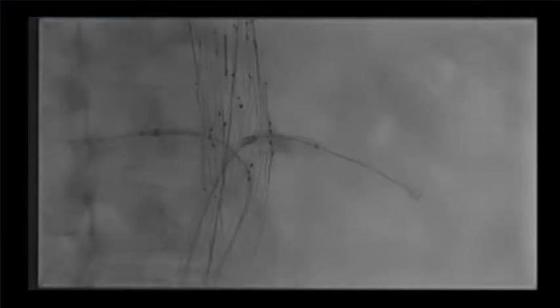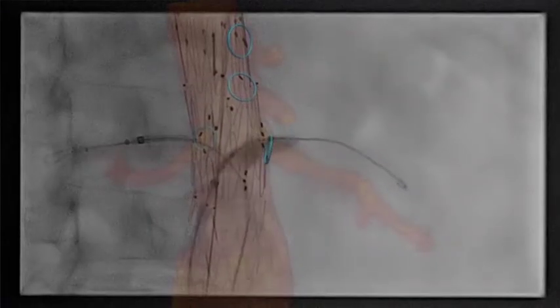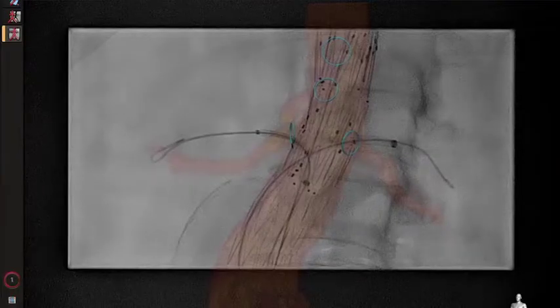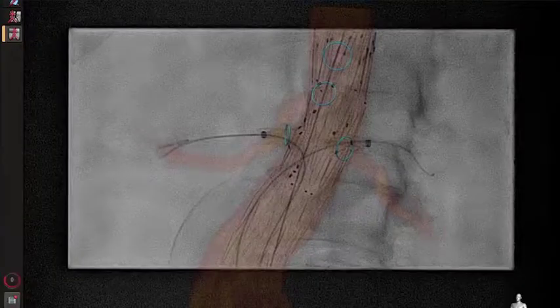We balloon our proximal sealing zone and then deploy our ICAST stents, first on the left. After deployment, we flare the portion that extends into the aortic lumen and perform a puff — there's a little bit of renal artery spasm, which we see on the right as well. Initial deployment followed by flaring in the aorta. You can see how our ring marks line up very nicely with the anatomic origin.